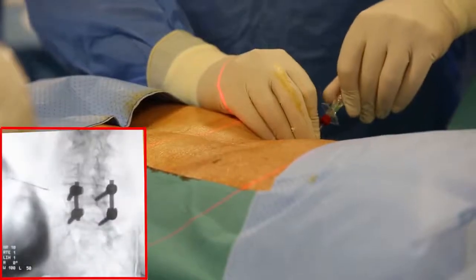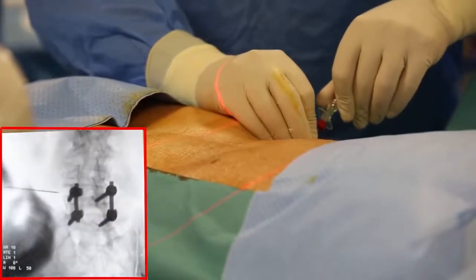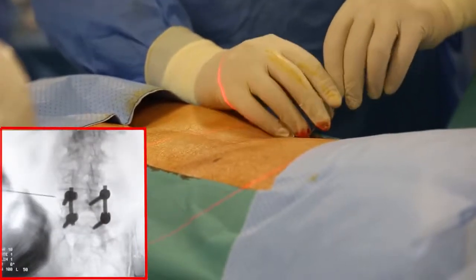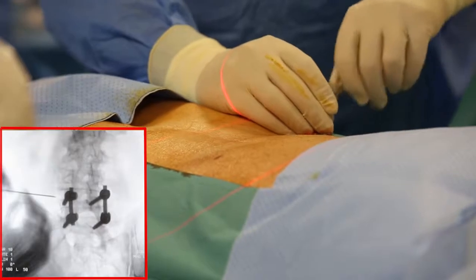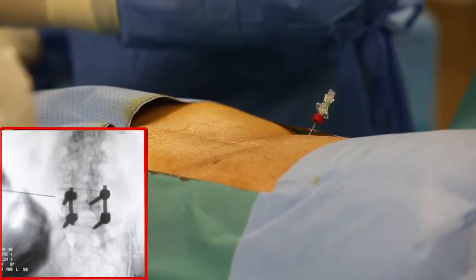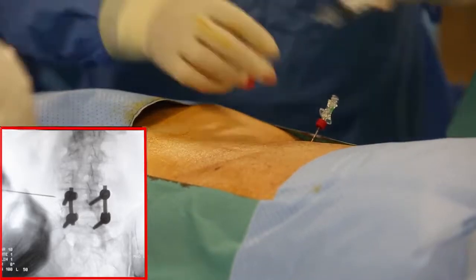Turn the monitor around to obtain a Scotty dog view. We need to enter immediately above the plate and the screw position on the right of the patient in order to access the inside of the disc. A landmark is precisely between the ear and the nose of the dog.